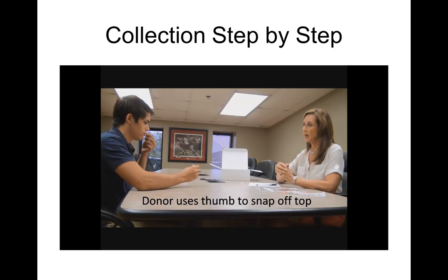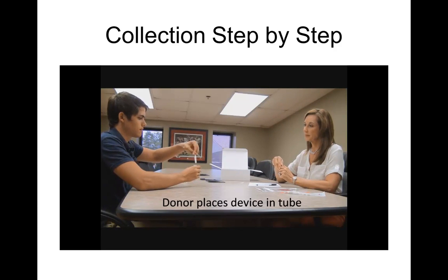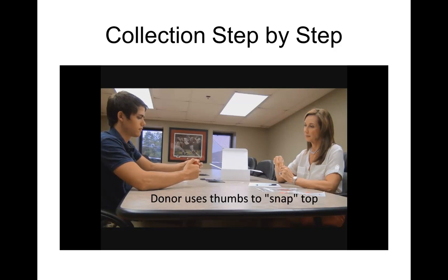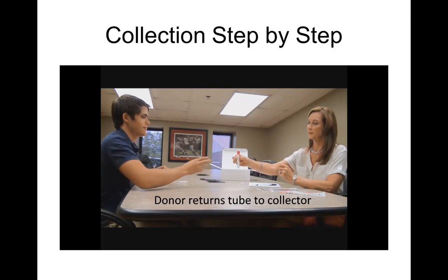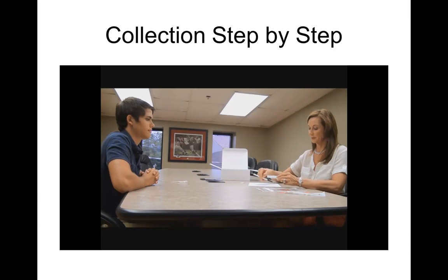Then the donor is going to take the Quantasol and place it down in the tube, and then they're going to put the top back on the tube. And I will tell you that once they put the cap back on the tube, it's not easy to snap back down. You can use both thumbs, and you want to make sure that you hear the snap. That lets you know everything is done, and then the donor will return the tube to the collector.